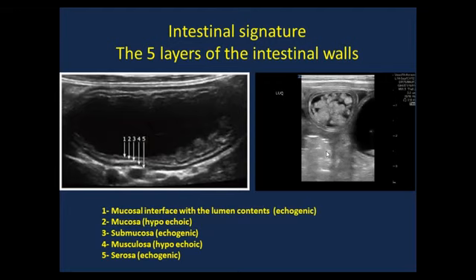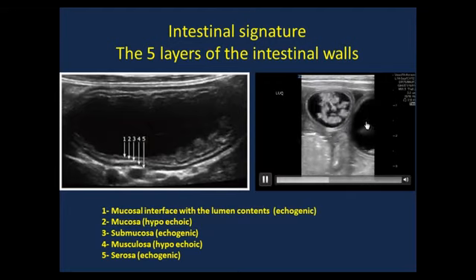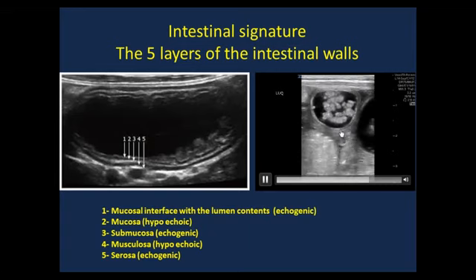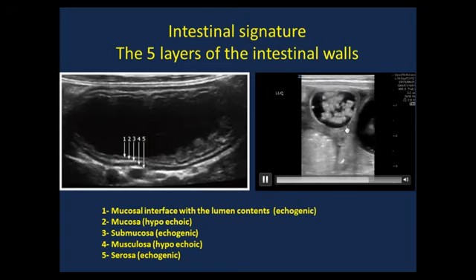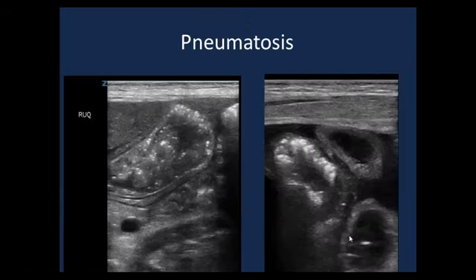And we can see that as well in this video clip, like multiple lobes of ileum, and we can see the ileal wall is composed of the 5 layers.